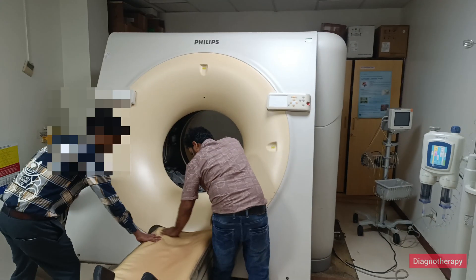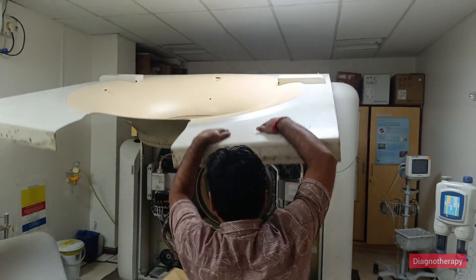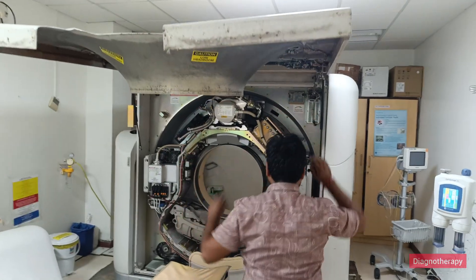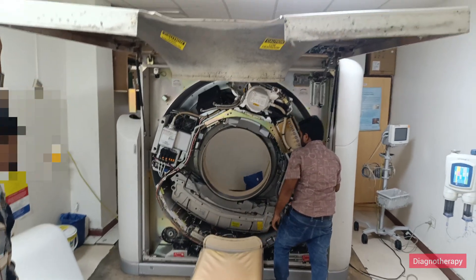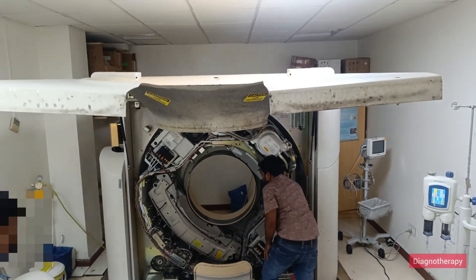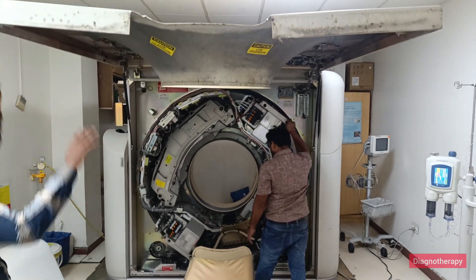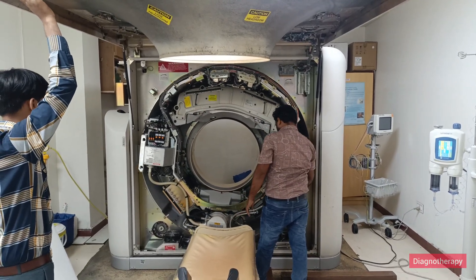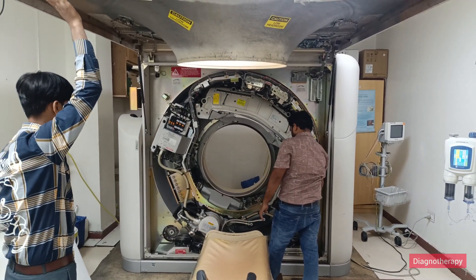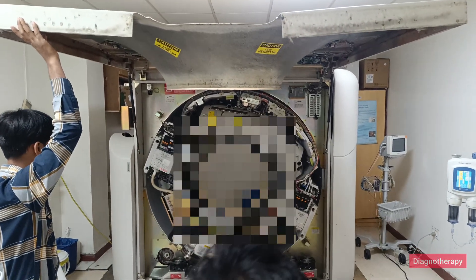If they are all correct, then we proceed to opening the gantry. Here we are opening the gantry — you can see the whole system is now open. We are checking all the parts and inspecting them carefully, slowly rotating and checking if all the parts are working correctly.